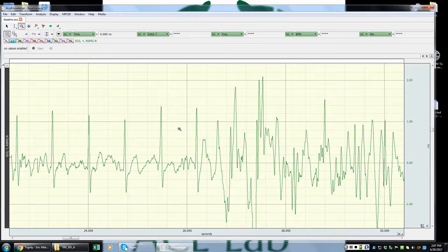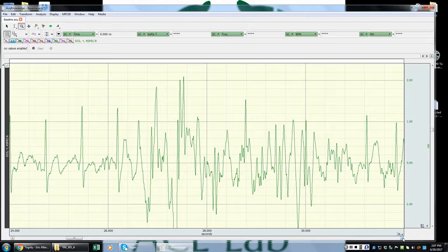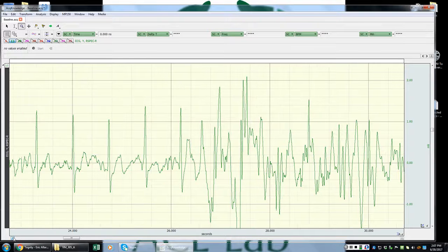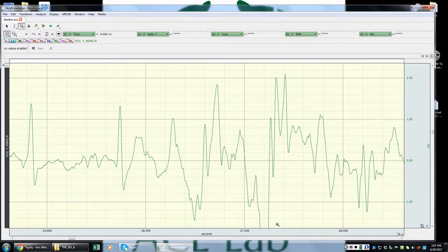we can more or less reliably identify where our true R peak should be located. Okay, so I'm not going to show you how we would clean this entire set, but I'm just going to give you a little bit of a rundown of how we would at least fix a couple of these waves. And once you've figured out how to identify which ones are the true waves, you'll start to get the hang of it after you've looked through these several times. All right, so what I want to do is start by just zooming in within this little range right here.